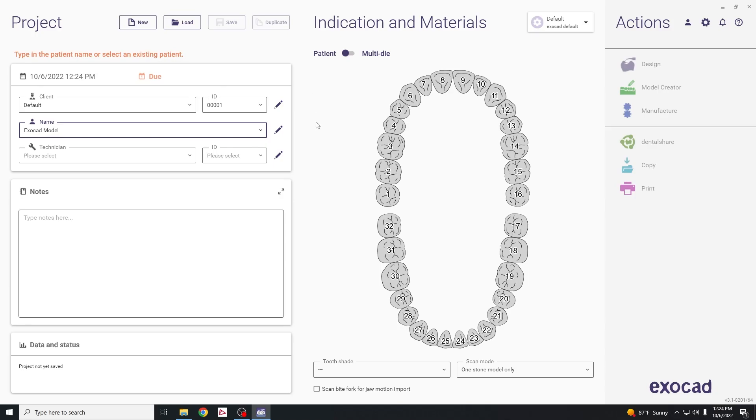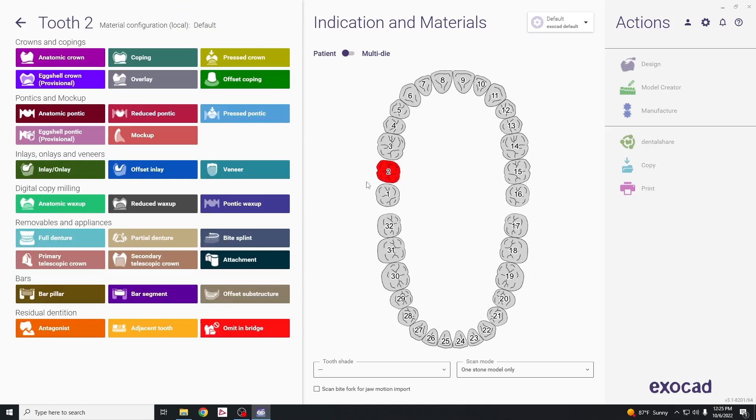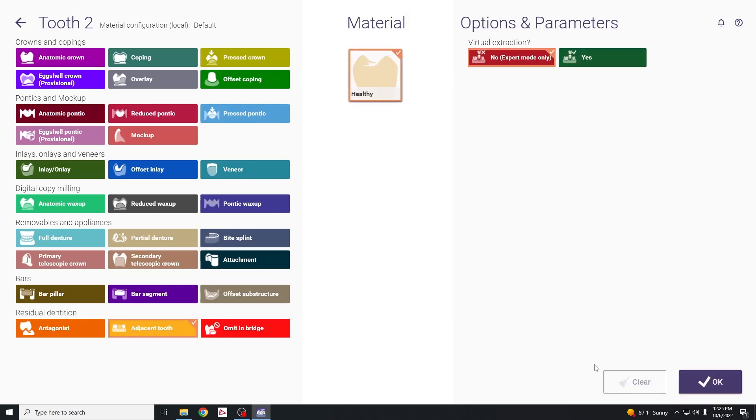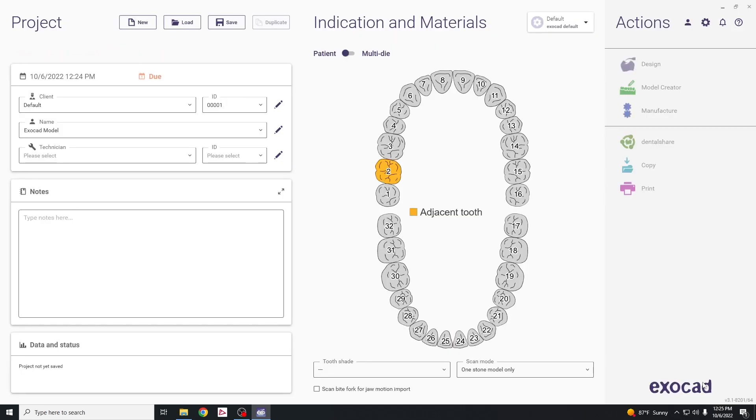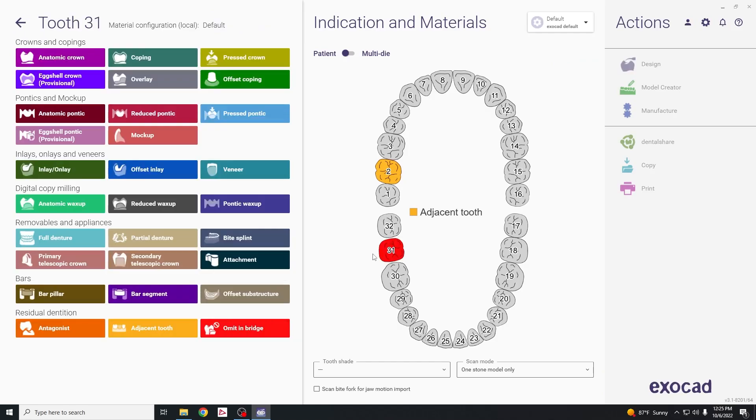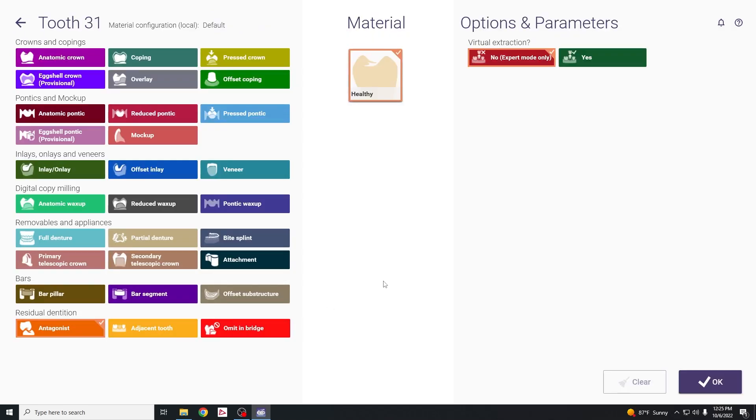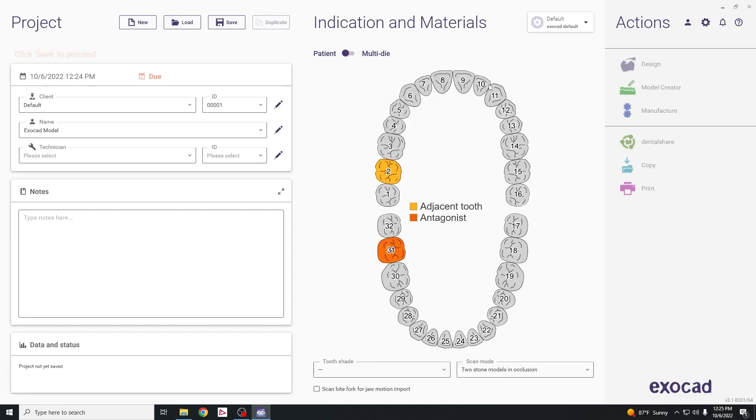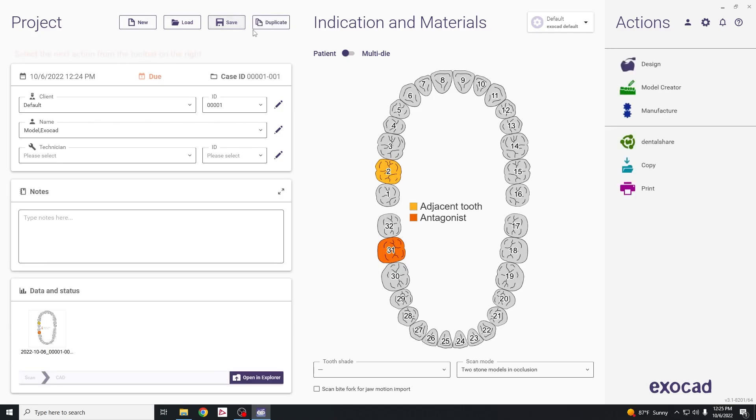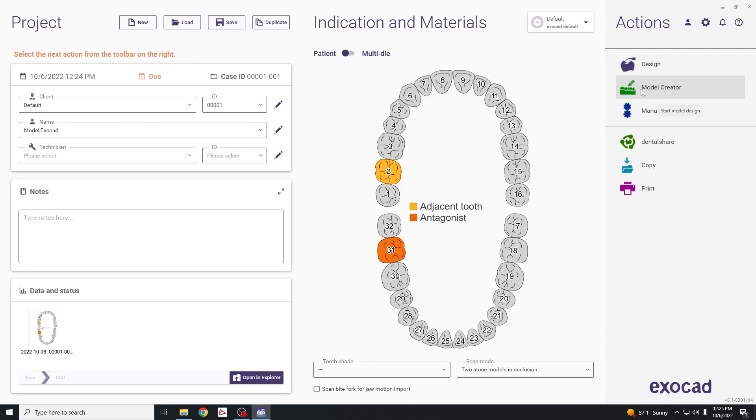Move to the right where you can click on one of the upper teeth and select adjacent tooth, hit OK, then for the lower hit one of the teeth and choose antagonists. Hit save, and once you save, the model creator button will be turned on and you can click that to start building the model.